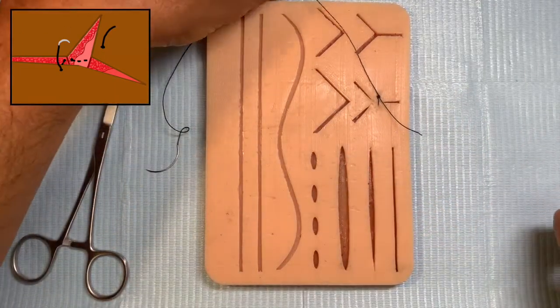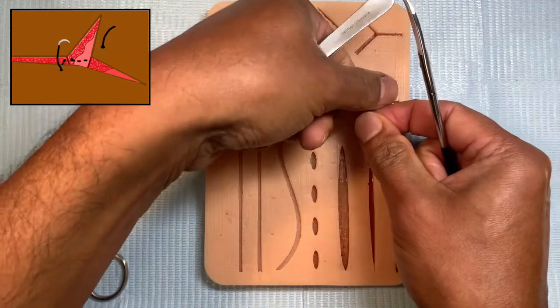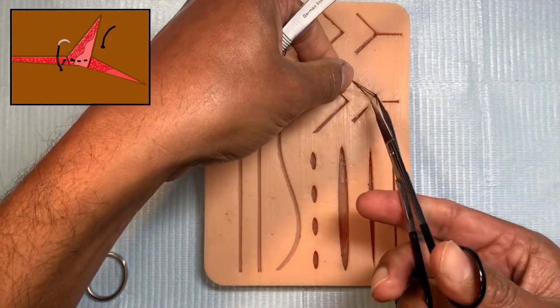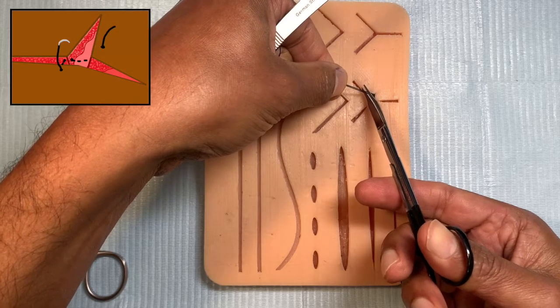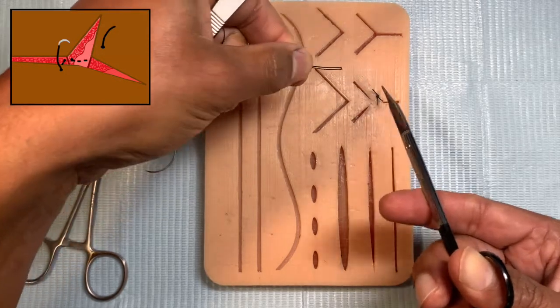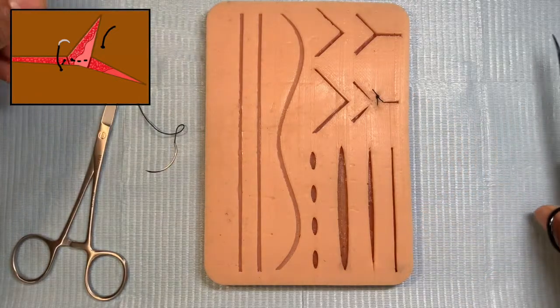The key element for this suture is that you take the pass through the triangle through the papillary dermis and don't take it too deep or too much on the surface.